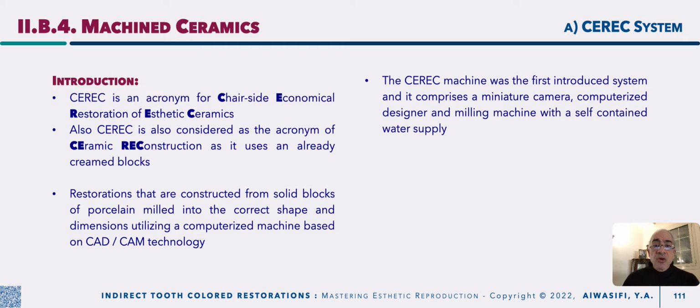CEREC is the acronym of Chairside Economical Restoration of Esthetic Ceramics. Sometimes it is considered the acronym of Ceramic Reconstruction because it uses solid blocks of pre-ceramed ceramic with definite shades.